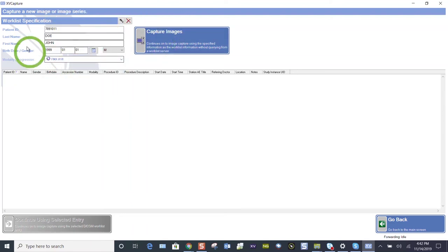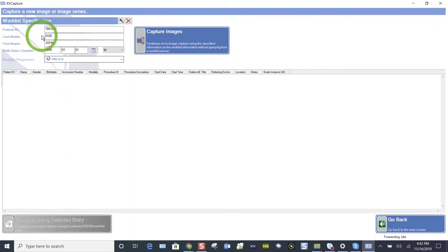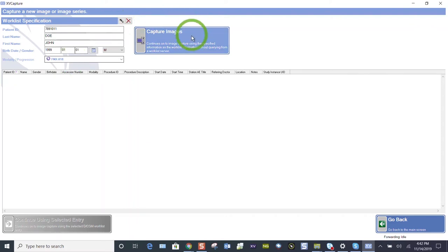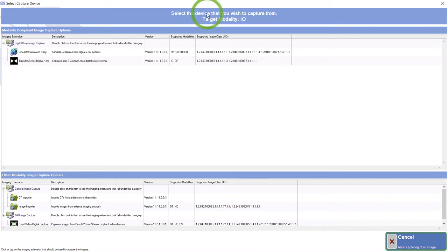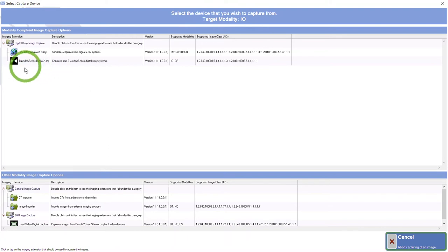Let's choose FMX 18. Once we've verified who we're taking images on and we've decided on what type of images we're taking, let's click on Capture images. We then have to tell the software exactly what device we are using. We want to make sure that whatever sensor we have in our hand that we're going to use to acquire those images will be listed here and we want to make that selection.